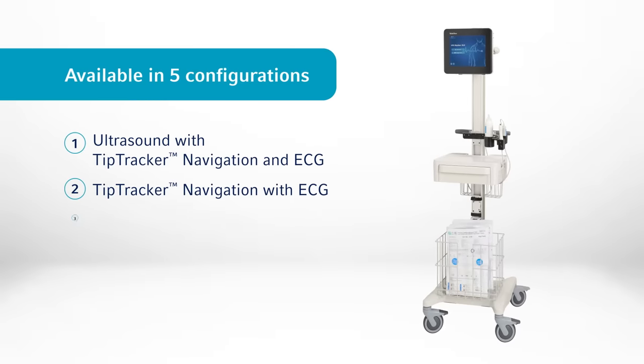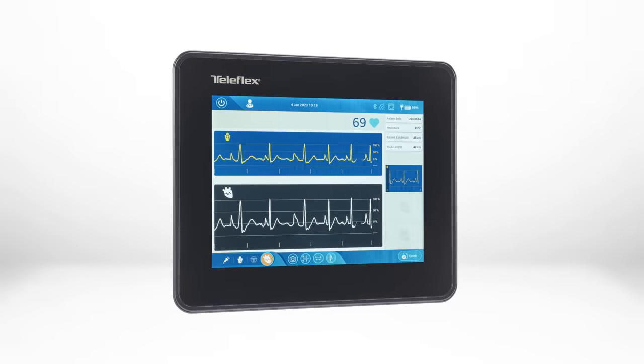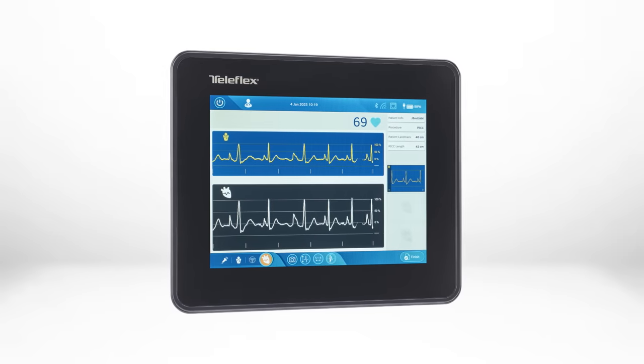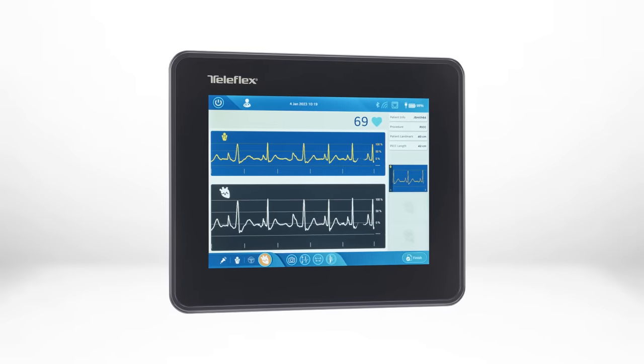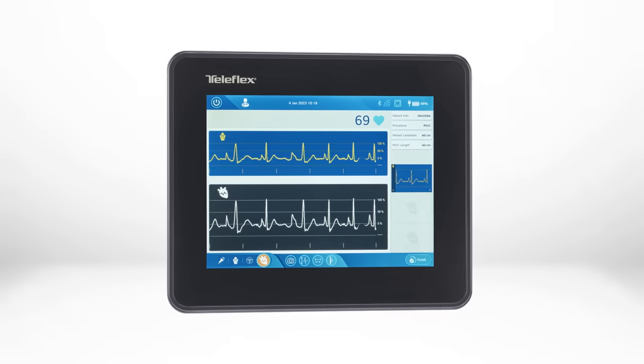The VPS Rhythm DLX device features integrated ultrasound for locating vasculature and tip navigation technology for clear visualization of the catheter as it is advanced through the body. The large display is intuitive and simple to interpret, enabling easy viewing of external and intravascular electrocardiogram waveforms.